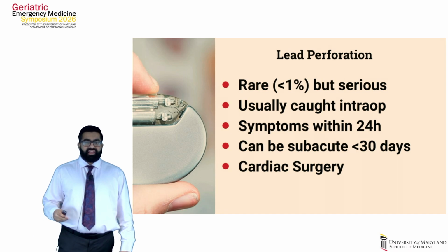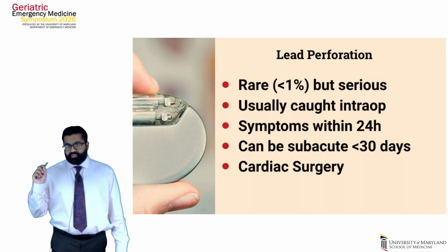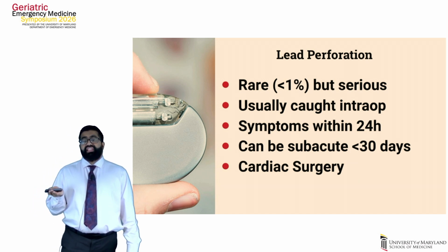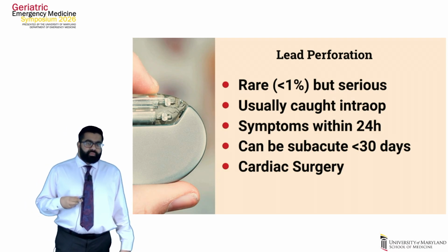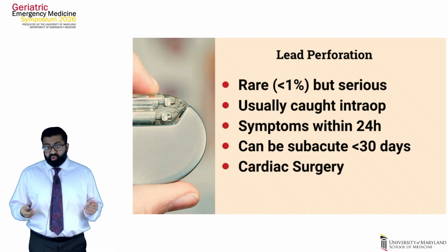Now, tamponade can occur with little lacerations of small veins or really even the myocardium, but a full-on lead perforation is quite different. These are very rare. We're unlikely to see them. They're usually caught intra-op because symptoms develop very quickly.